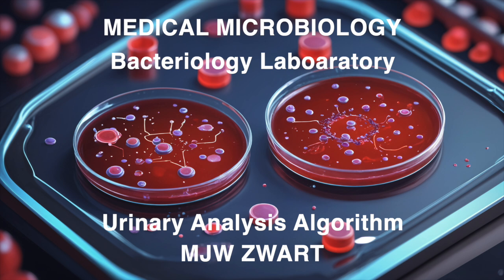Exactly. And for other types of specimens, like biopsies, cerebrospinal fluid, or heart valves, the recommendations are quite different. They are. So for those more specialized specimens, the recommended storage time is much longer. Oh, wow. 3 months at -70 degrees Celsius. Wow, that's quite a difference. Why such a long storage time for those? Well, those types of samples are often associated with more serious infections. And the information they contain can be crucial for a longer period. I see. Like recognizing that those samples hold valuable clues that might be needed for a more extended investigation.